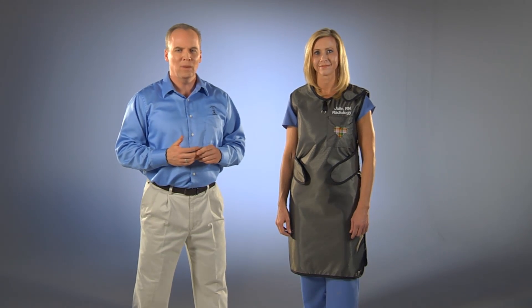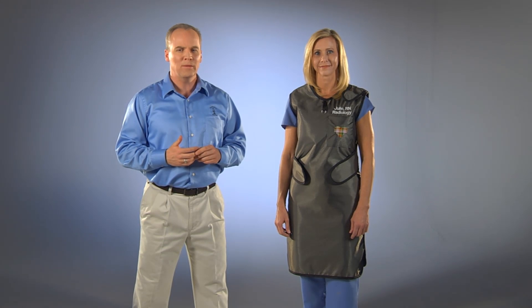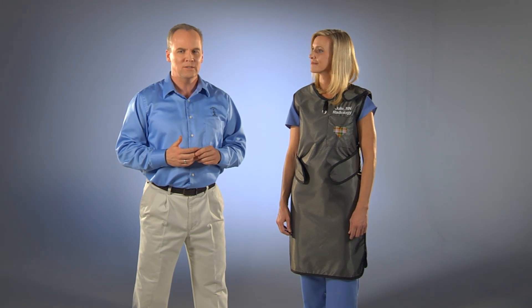Like all of our premium aprons, the Euro One is available in our lightweight, lead-free and viral light, as well as reduced weight burlite and regular lead. Protective levels offered are 0.5mm, 0.35mm, and 0.25mm lead equivalency.